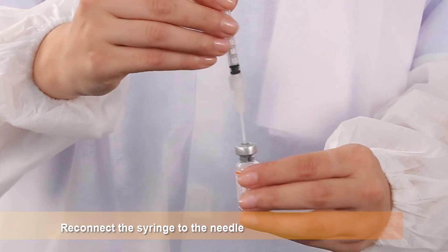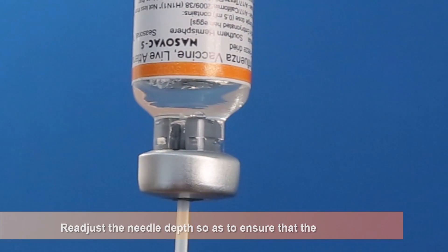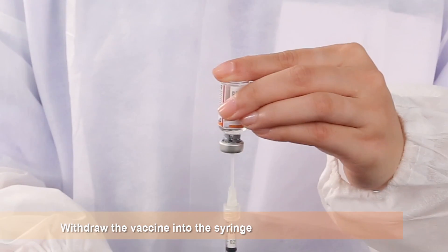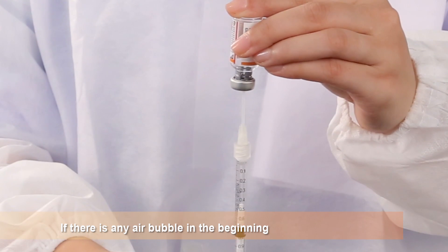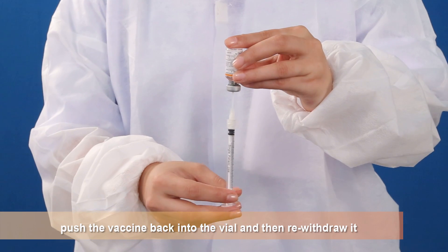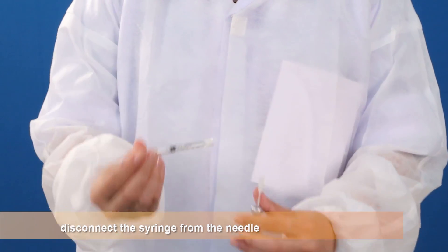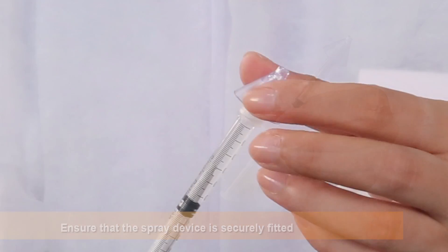Reconnect the syringe to the needle. Readjust the needle depth so as to ensure that the entire contents of the vial are withdrawn during the next step. Withdraw the vaccine into the syringe. If there is any air bubble in the beginning, push the vaccine back into the vial and then re-withdraw it. Once the entire vaccine is withdrawn, disconnect the syringe from the needle. Ensure that the spray device is securely fitted.